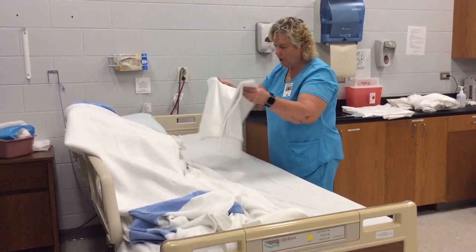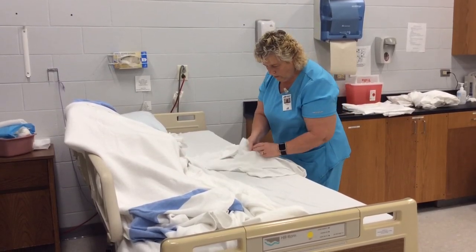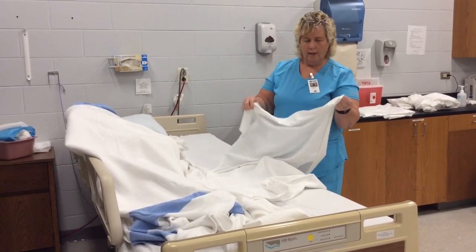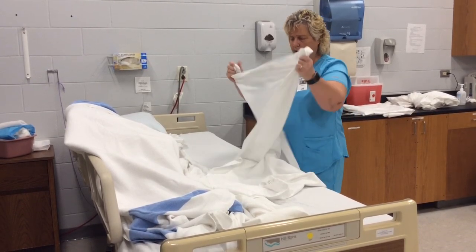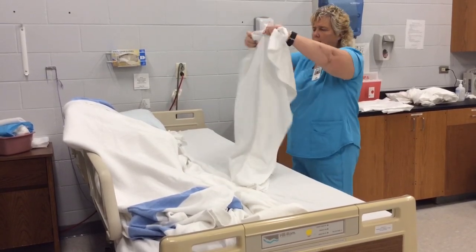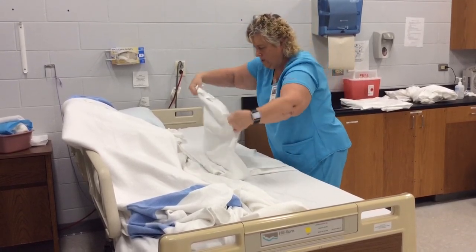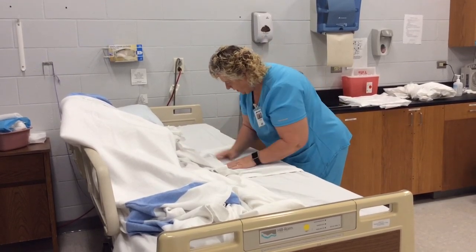We talked about the draw sheet in the unoccupied bed making skill, if you want to go back and look at it, but I'm going to recap here just a little bit. There's a side that is folded over, and that is called the closed side, and there's a side that's open, and that's the open side. So we're going to turn this around. I'm going to gather it like this, and this is called fan folding. Just kind of do a little accordion there, and then unfold it and get your wrinkles out.